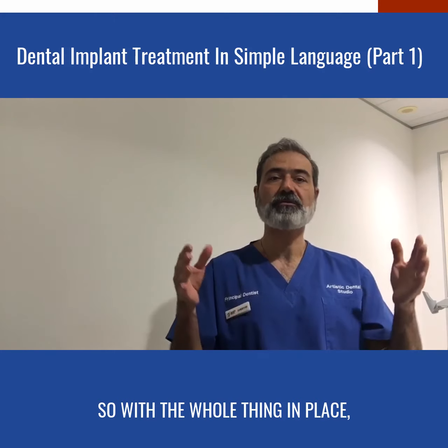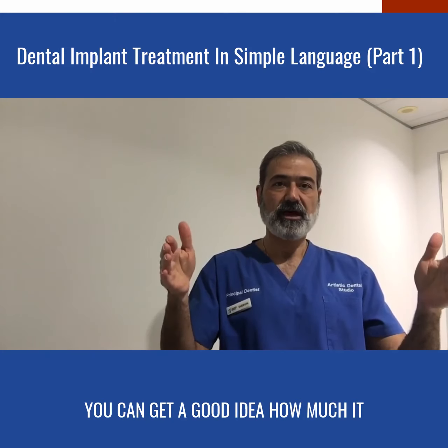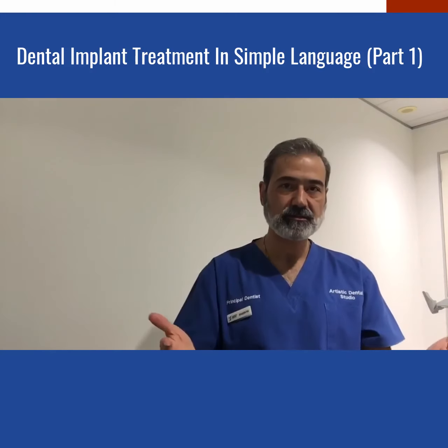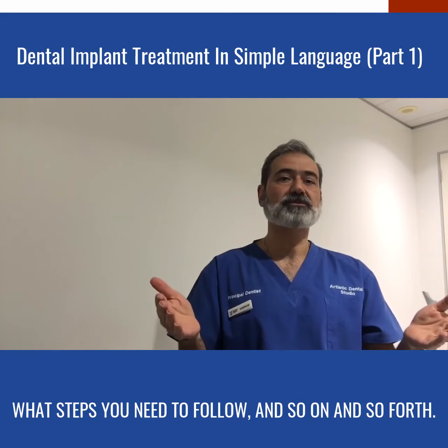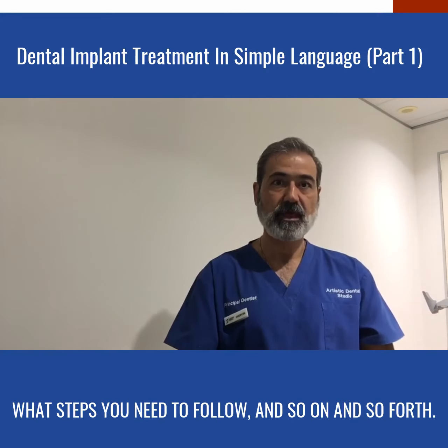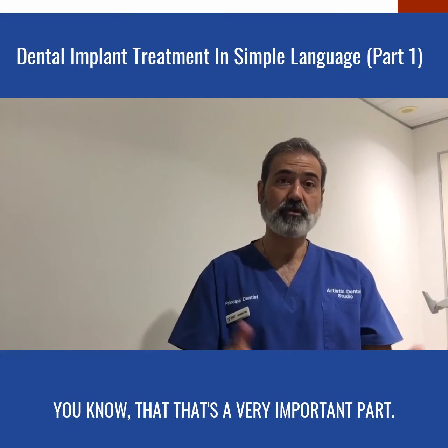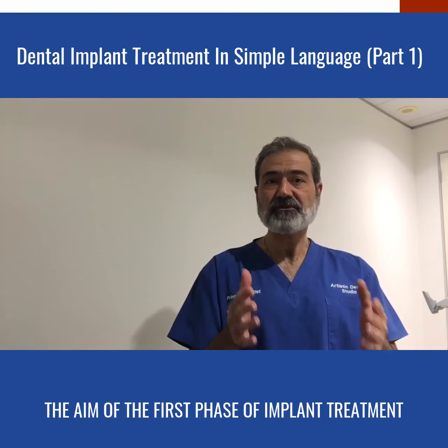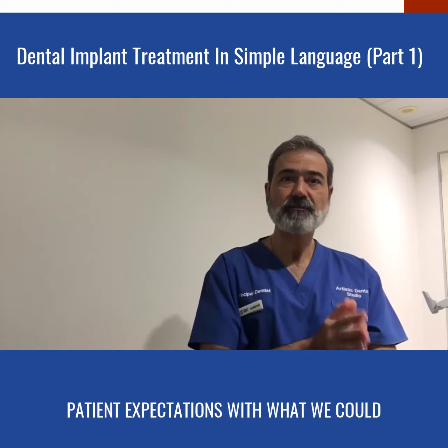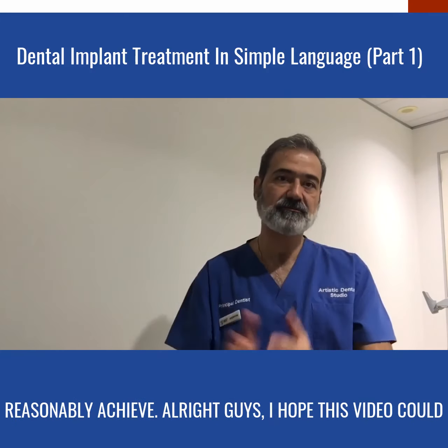So with the whole thing in place, you can get a good idea how much it would cost, how long it would take, what steps you need to follow, and so on and so forth. And also what you need to do after the treatment. That's a very important part. The aim of the first phase of implant treatment, which is the diagnostics, as I said, is to match patient expectations with what we could reasonably achieve.